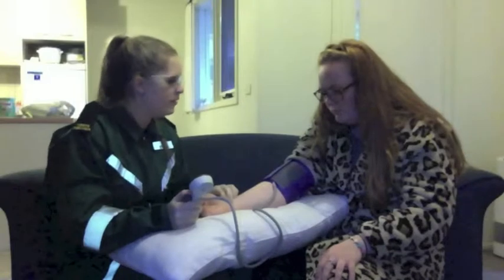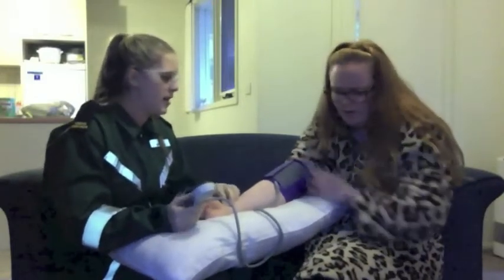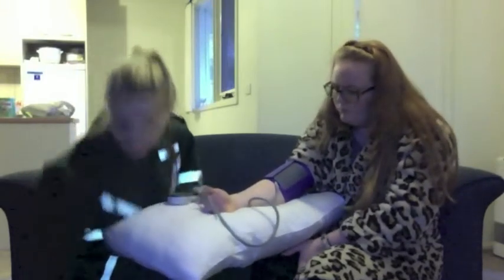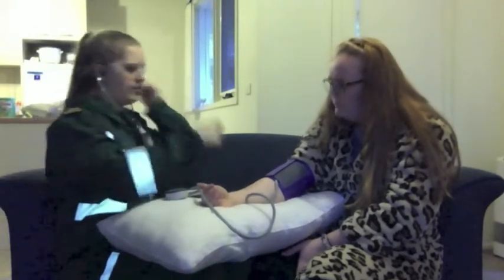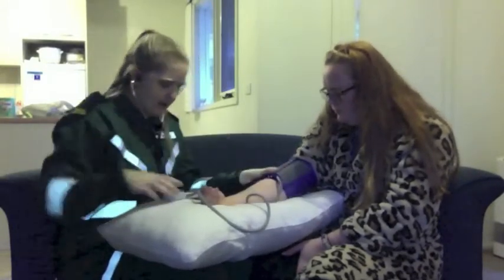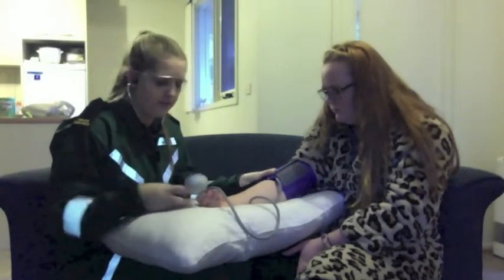Good. Is that not too bad, Mrs. Jones? Is that okay? Yeah, that's alright, it's a bit tight. A little bit tight? That's okay. So we've just got one more to do. So I'm also going to auscultate Mrs. Jones's blood pressure. So what I'm going to do, Mrs. Jones, I'm just going to have a listen this time rather than feeling, alright? So I'm just going to stick this up in here. So again, I'm going to pump the cuff up again to where I felt her systolic blood pressure.